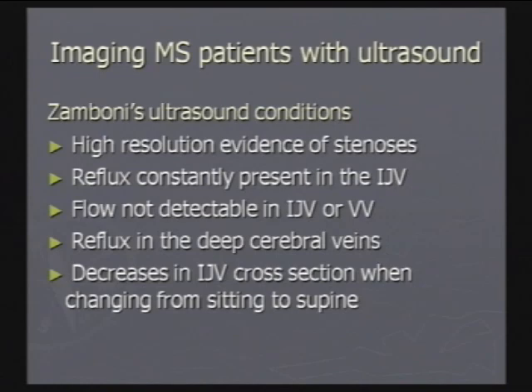Is there reflux present in the internal jugular veins, or no flow? Is there reflux in the deep cerebral veins, or is there a decrease in the jugular vein cross-section when you change from sitting up to supine? Because generally speaking, we know from the comments you heard earlier that the vertebral system does the most job while I'm standing up here. And if I lie down, the jugulars open up, or at least they should open up, and they provide more of the flow when you're lying down.